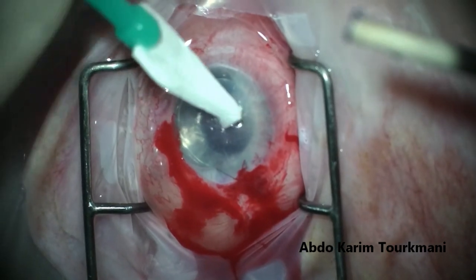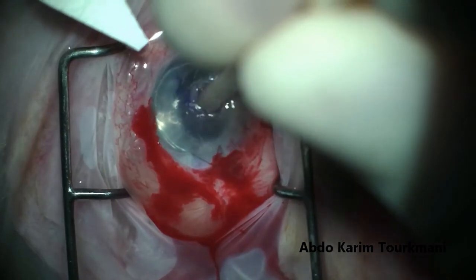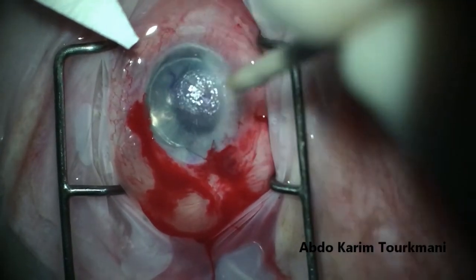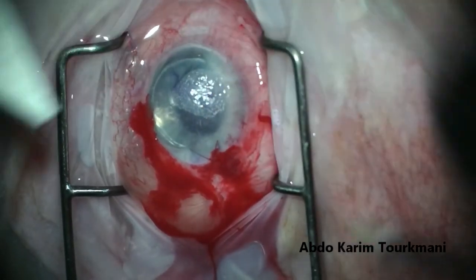glue patch. So just in case there was a graft detachment, I wouldn't have again a leak and a very shallow anterior chamber. The graft would at least remain attached where the glue patch is. Thankfully, it remained attached all the way around, and the patient is evolving satisfactorily.